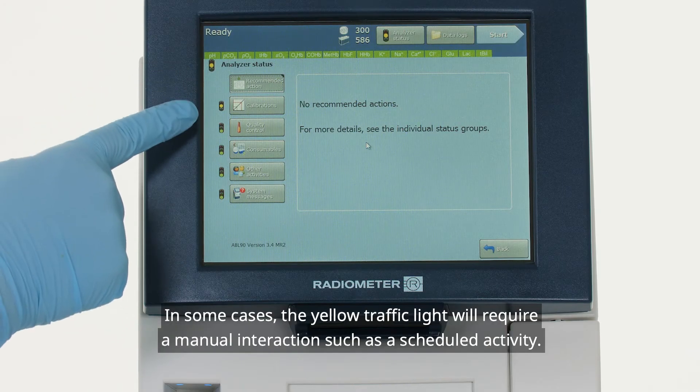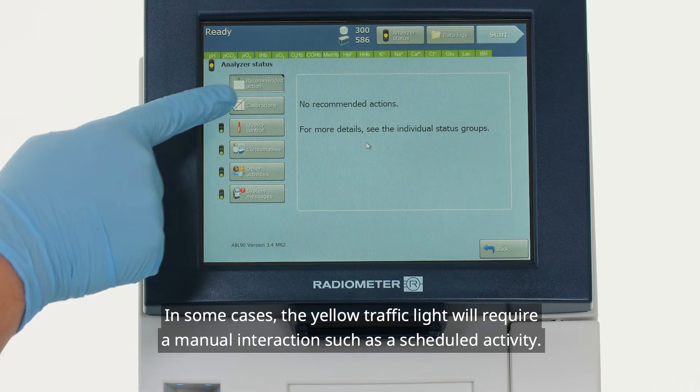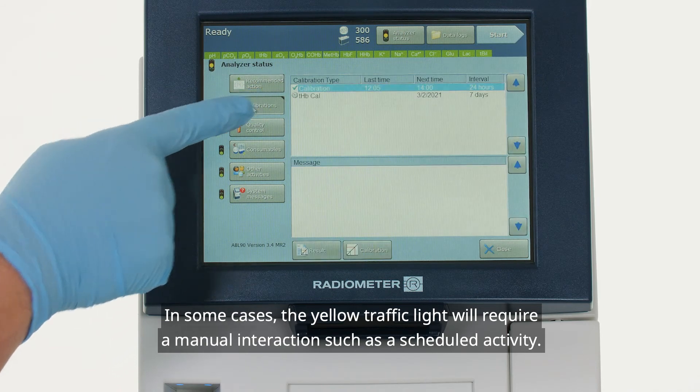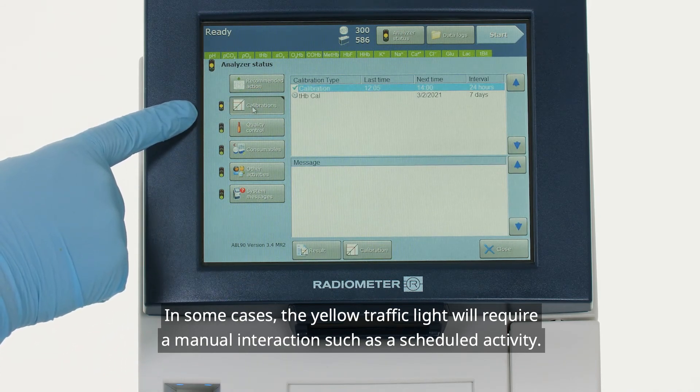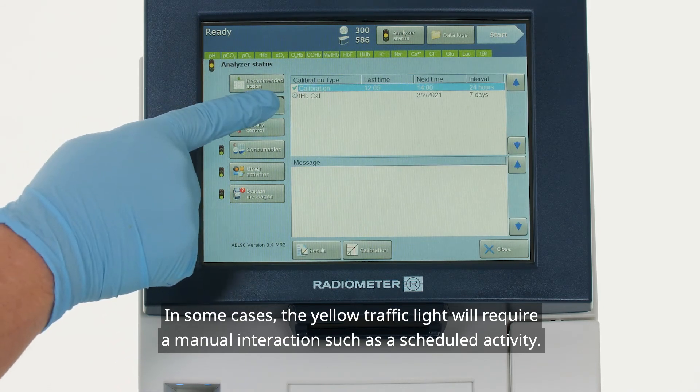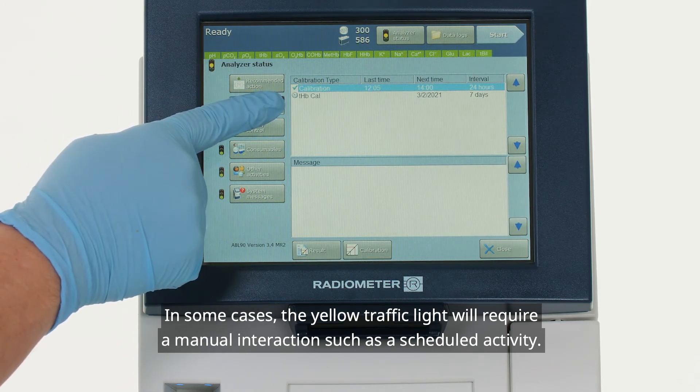In some cases, the yellow traffic light will require a manual interaction, such as a scheduled activity.